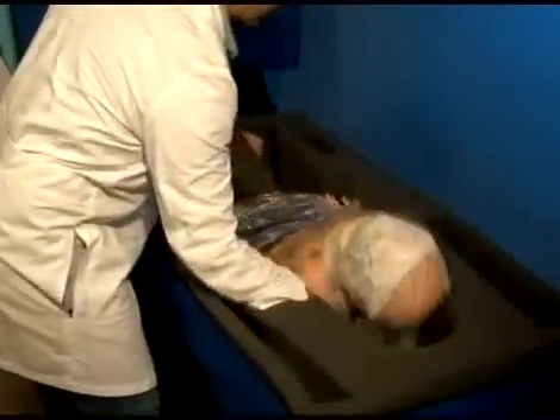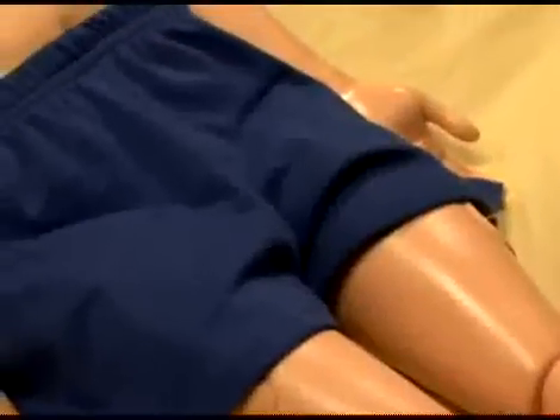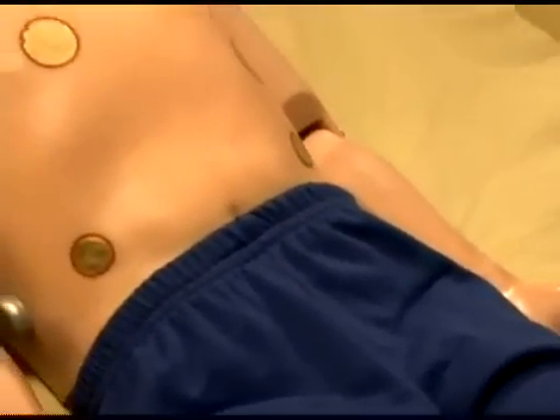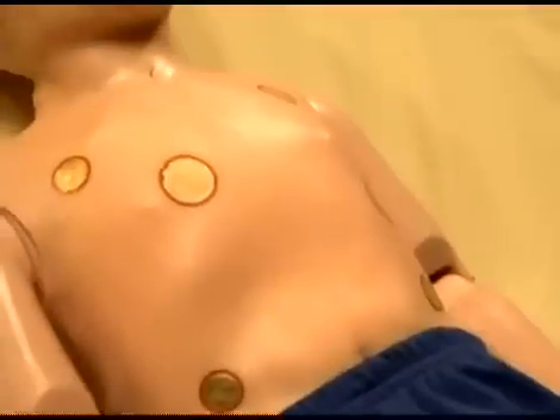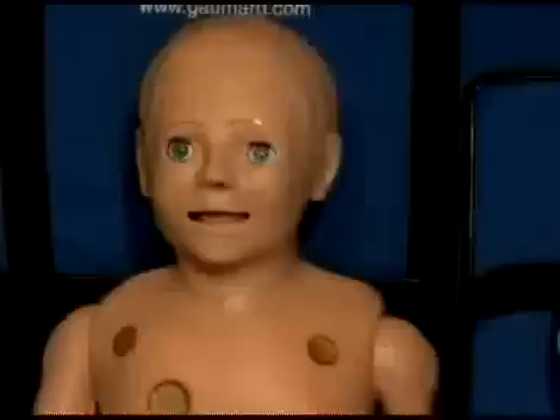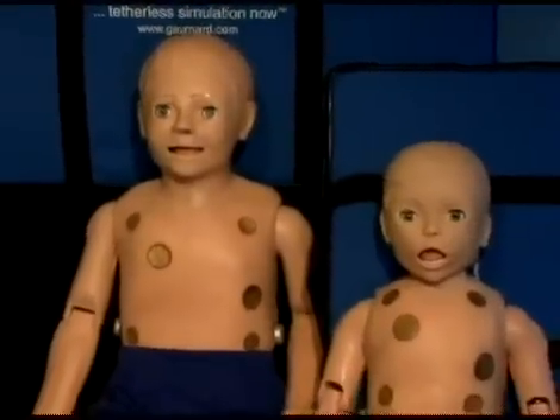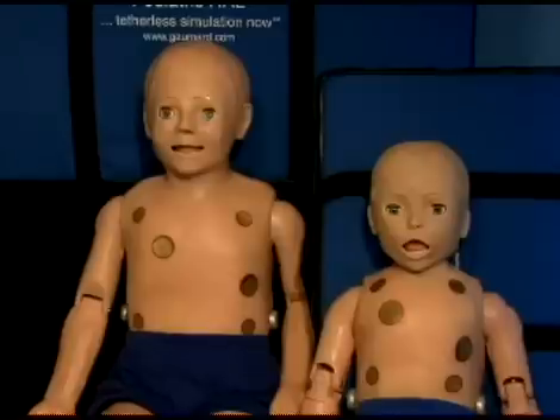Remove the pediatric mannequin from the case. Notice that it is fully assembled and ready for use. It is, however, strongly recommended that the battery be fully charged prior to use. The pediatric simulator is available either as a five-year-old or a one-year-old.